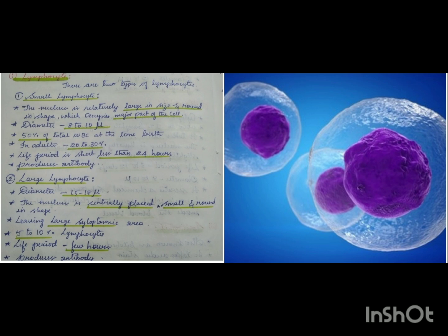Large lymphocyte, its diameter is 15 to 18 microns. The nucleus is centrally placed. It is small and round in shape, leaving a large cytoplasmic area. It is about 5 to 10%. The lifespan is a few hours. It produces an antibody.